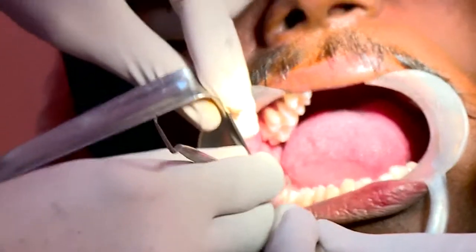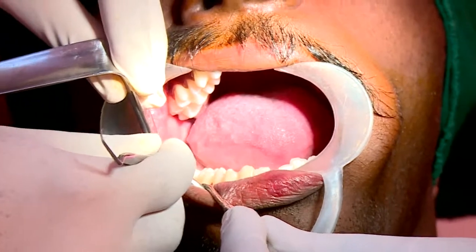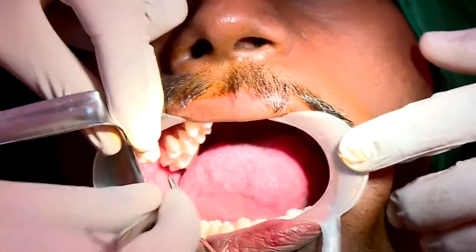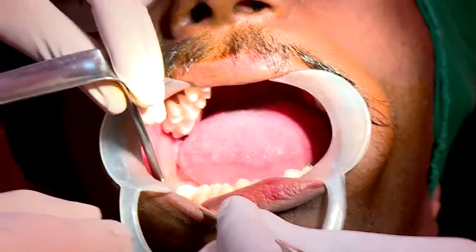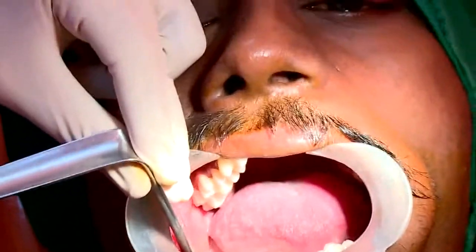So, the anterior releasing incision: you do not cross the attached gingiva. You do not go to the free mucosa while making the anterior releasing incision. You have a lot of bleeding if you cross the attached gingiva. Basically, it is a modified incision on the mesio-buccal, disto-buccal line angle of the first molar.